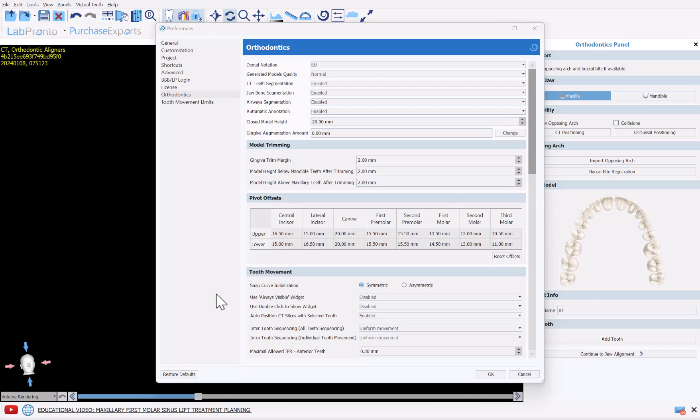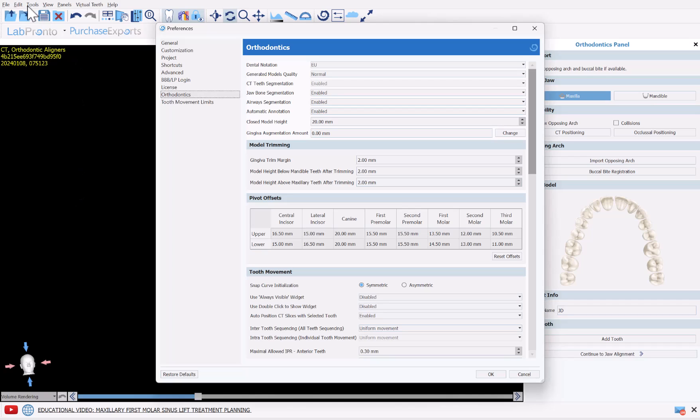Before we continue with the process flow, I'm going to show you, as I mentioned earlier, how you're able to control exactly which automatic segmentation should happen by default for your cases. So what I did is I went into Tools and I chose Preferences. Tools from the menu here and I chose Preferences, chose Orthodontics.